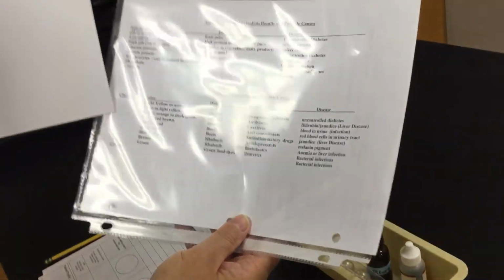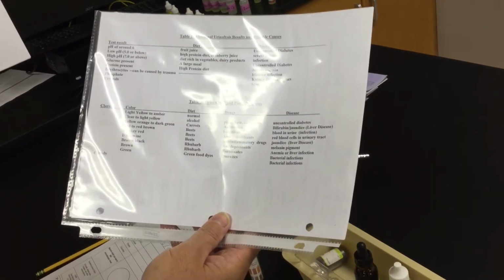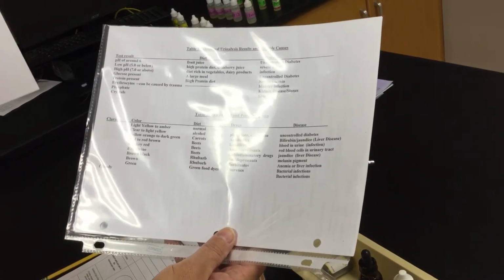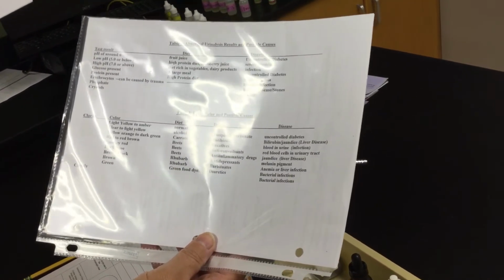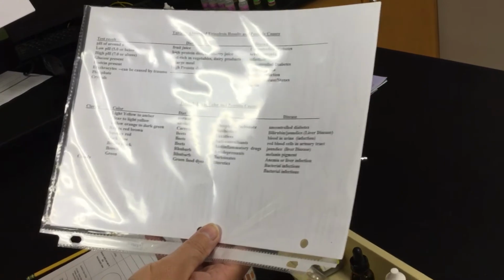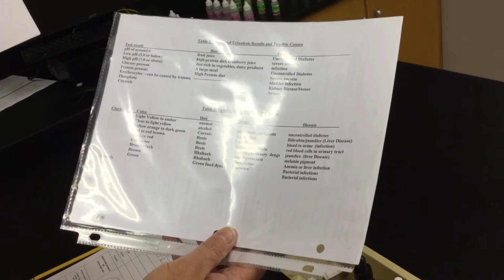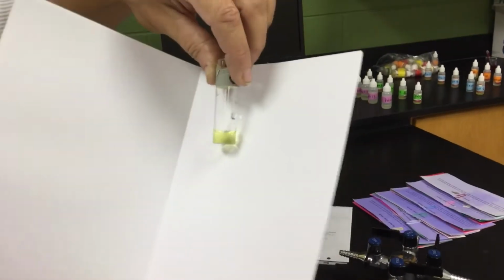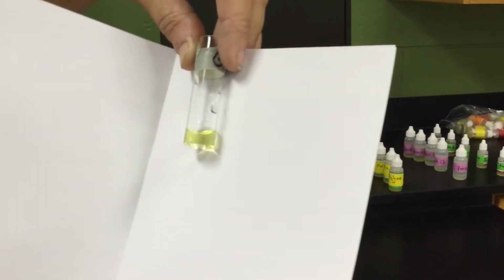So you'll see some colors down there. Light yellow to amber is your normal, clear to light yellow. It can be anything from alcohol that changes it, foods that you eat that have carotenes in them, like carrots. Beets especially will change it, where it's going to turn kind of bright red. Different foods. So you guys will see that there as well. So if we're looking at it, I would say it's kind of a light yellow in terms of that particular urine. So I would mark that under color.